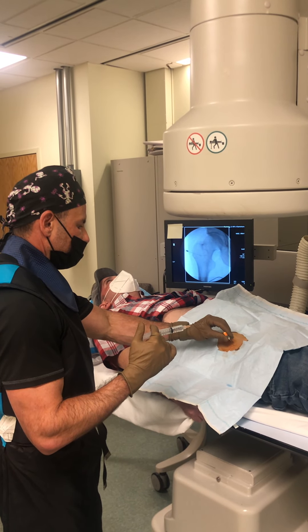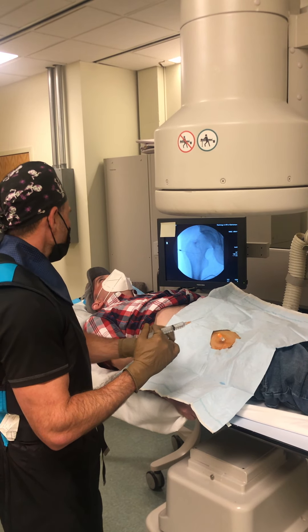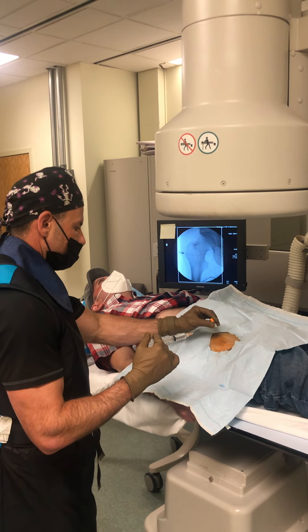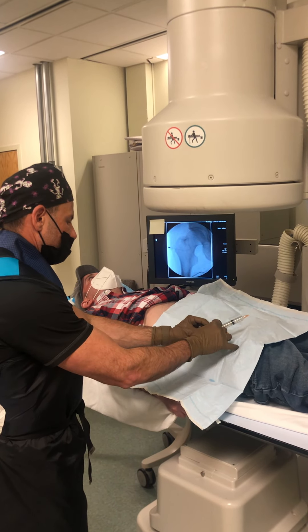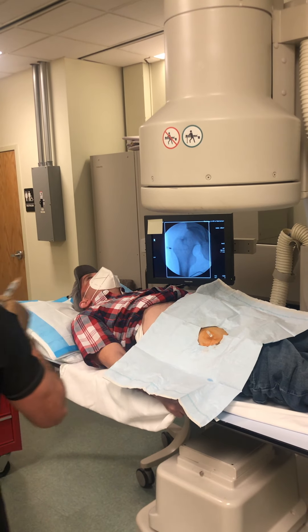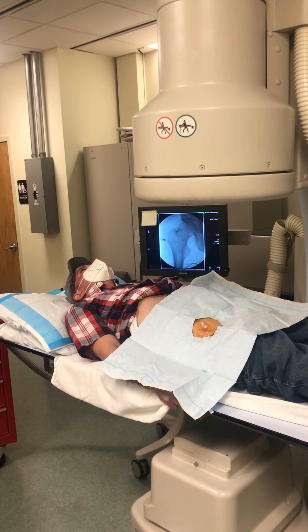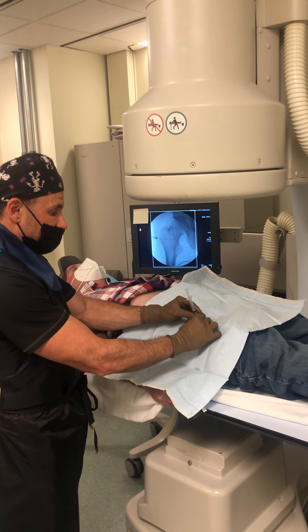We're going to use this thin needle placed right inside the hip capsule. It goes right along the edge of the hip, and the reason for that is so we can outline the actual hip using contrast.